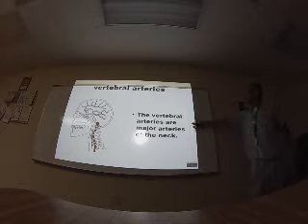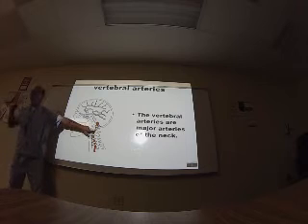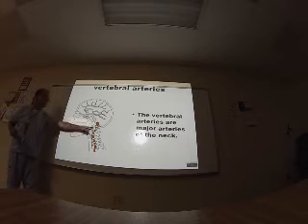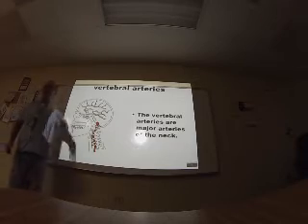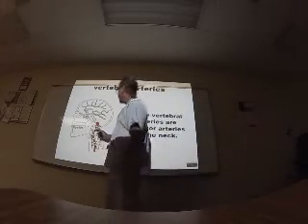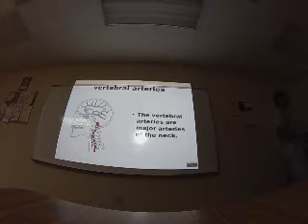Vertebral arteries. The vertebral arteries are major arteries of the neck. What is the very important characteristic that helps in ultrasound to localize the vertebral arteries? Here, when you put the transducer, the bone produces a shadow, and that lets you know that you are scanning the vertebral arteries. When you are scanning the carotid, you can recognize the vertebral arteries very easily because they go through little holes. What is the name of these holes? Transverse foramen. The vertebral arteries go through the transverse foramen, enter through the foramen magnum and go in the head to finish in the Willis polygon.